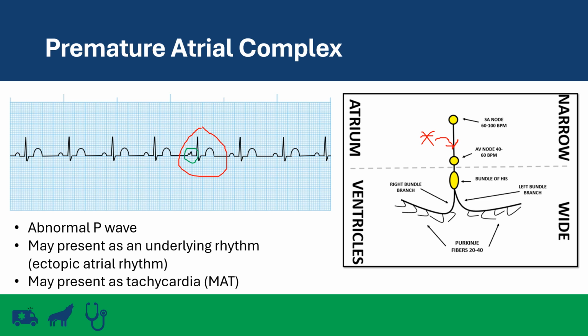So in this particular pattern, we have a normal sinus rhythm with a PAC, and that is evident because we have an abnormal P wave and a narrow QRS complex. We know that this is not a PJC, because remember PJCs have narrow QRSs too, but they either shouldn't have a P wave, should have an inverted P wave with a shortened PR interval, or will have a late P wave. In a PAC, we have an obvious P wave, it just looks abnormal.